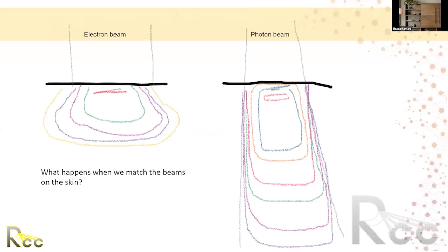and sometimes when you're just going into 3D planning, you would do everything photons on the planning system. And then with electrons, you just do, oops, I apologize. Sorry, my video is off. When you start doing 3D planning, you'll do everything photons on the planning system, and then you keep the practice of electrons being just pen and paper.